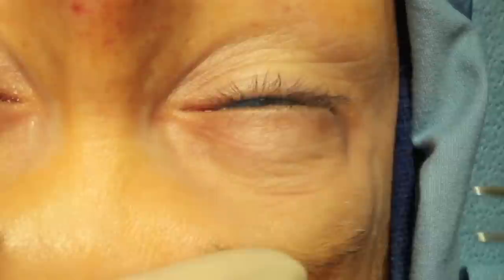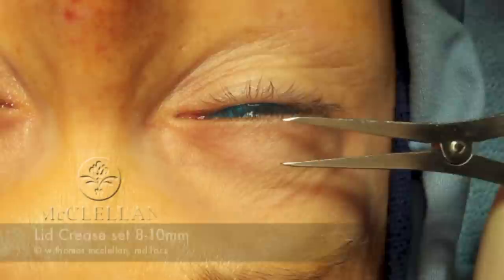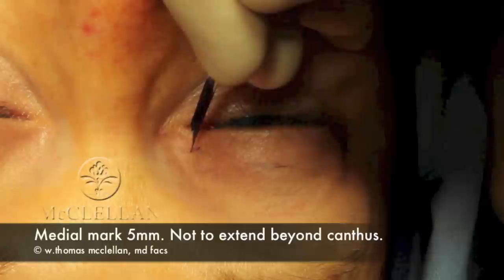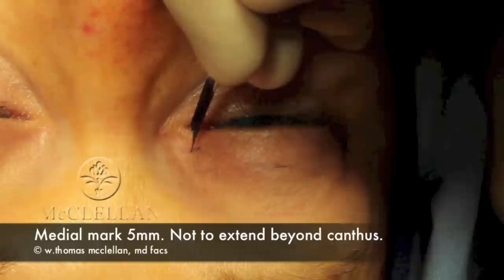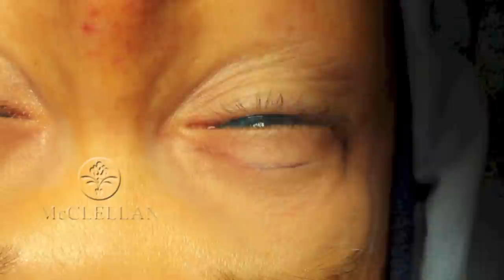These are the markings for the incision that I utilize. This starts at the central portion of the eye above the iris. I make a mark along the natural eyelid crease, which is typically between 8 and 10 millimeters. I then make a mark lateral to the lateral canthus by 6 millimeters and slightly cephalad of that. My medial mark is 5 millimeters in length and does not encroach upon the medial canthus. Then I join those together in a curve which follows the natural eyelid crease, until the medial and lateral are joined, as you can see here.